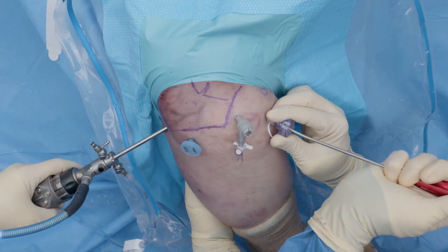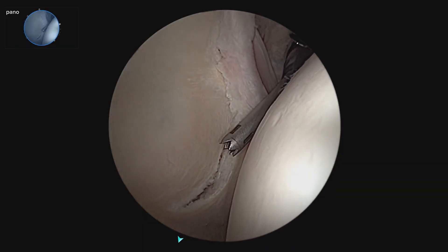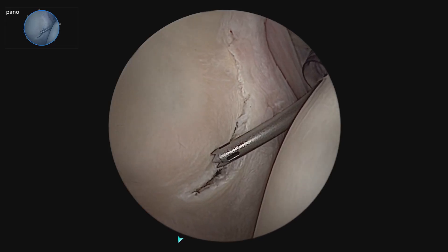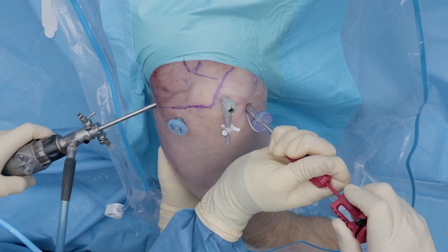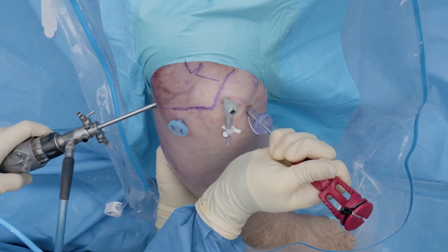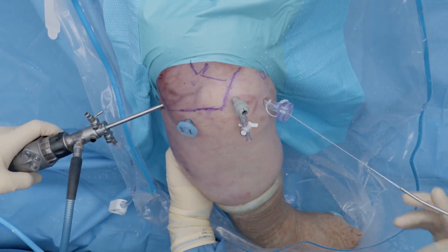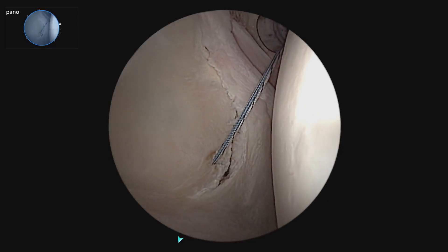So now we are going to start the Bankart repair. We bring in our curved drill guide, which has a laser line for the direction of the curve, and we can get way down low and angle it into the glenoid surface. We insert the anchor and mallet it in flush with the handle, then release the sutures and remove everything, grab the sutures, and seat the anchor again.